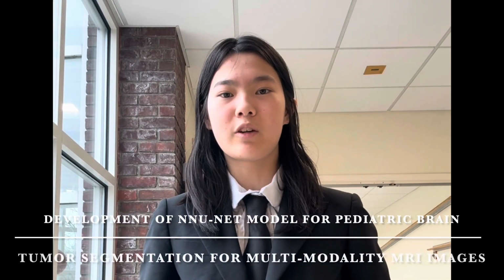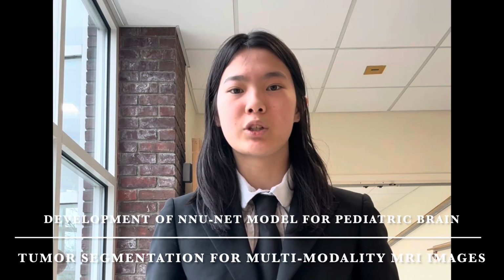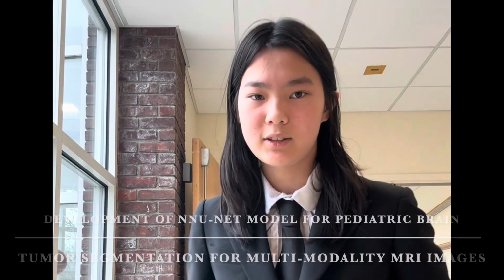I'm a Greenwich High School sophomore, and my project is to make a machine learning model that can segment pediatric brain tumors from multimodality MRI scans. Brain cancer is often treated through radiotherapy or surgery, both of which require a precise segmentation of the tumor, often drawn by physicians. This process can be time-consuming and subjective when done by human hands.